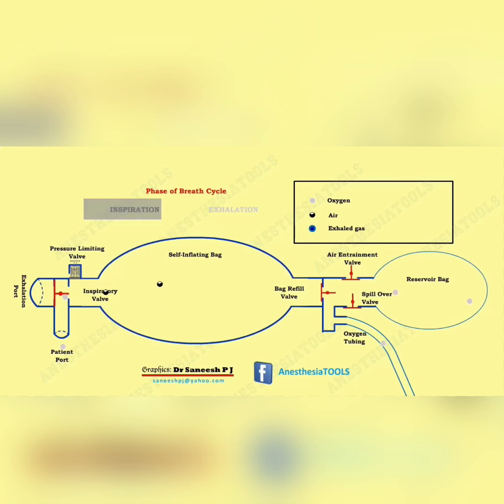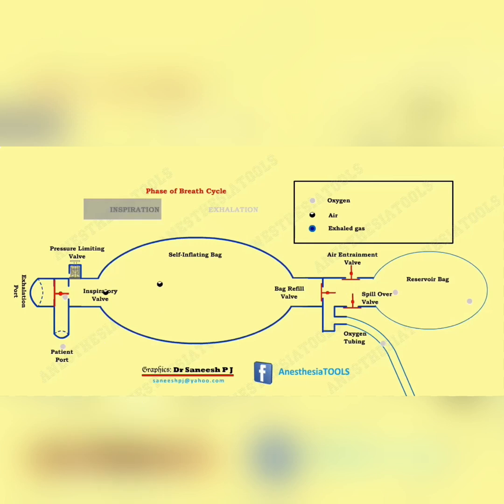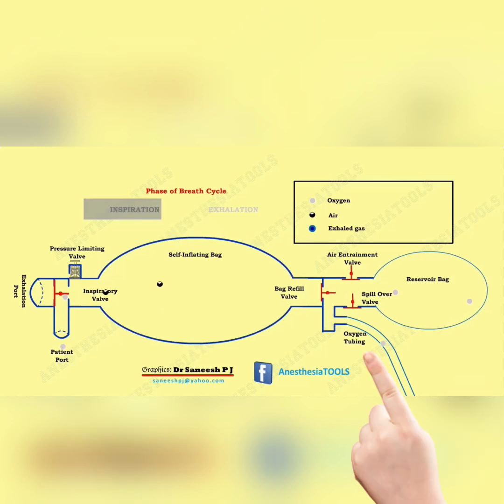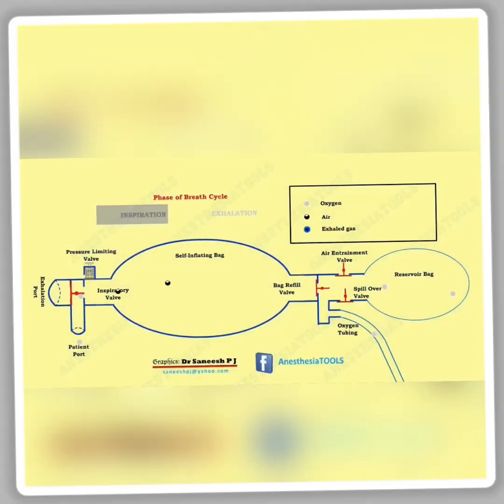At the patient end you can find the patient port and the inspiratory valve. At the other end you can find the reservoir bag is attached and an oxygen tubing is attached. You can also find the bag refill valve, the air entrainment valve, and the spillover valve.